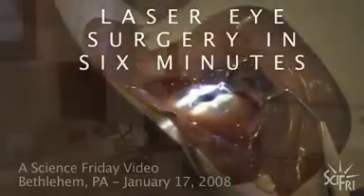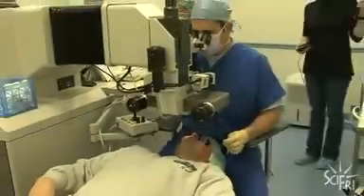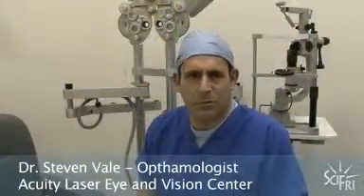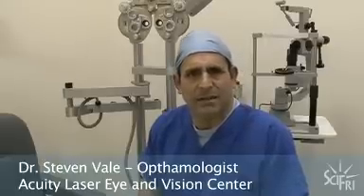Today we're going to Bethlehem, Pennsylvania to watch a LASIK eye surgery performed. Our guide is Dr. Steven Vale of Acuity Laser Eye and Vision Center. I'm a cornea specialist and ophthalmologist, and I perform refractive surgery, primarily laser vision correction, LASIK and PRK. LASIK and PRK treat lower order aberrations, which laypeople know as nearsightedness or farsightedness and astigmatism.